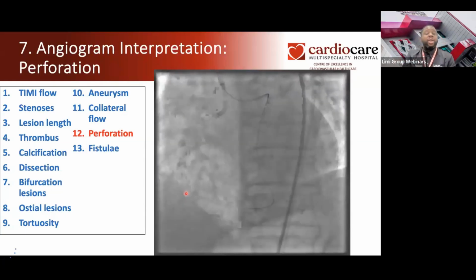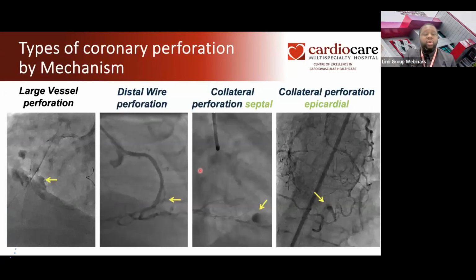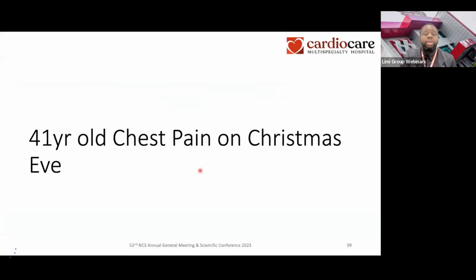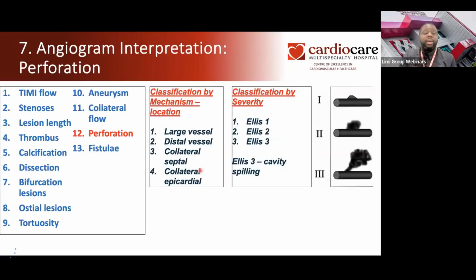So that is number one, depending on how severe it is. Another way you can do, depending on the severity, is sometimes just balloon tamponade. Take a coronary balloon there and then just inflate the balloon to tamponade it till it heals, typically in the mild ones, Ellis 1. But once it is big, you typically have to use a covered stent, and that could happen in different things. Okay, so we've gone through all of these ways through coronary angiogram.